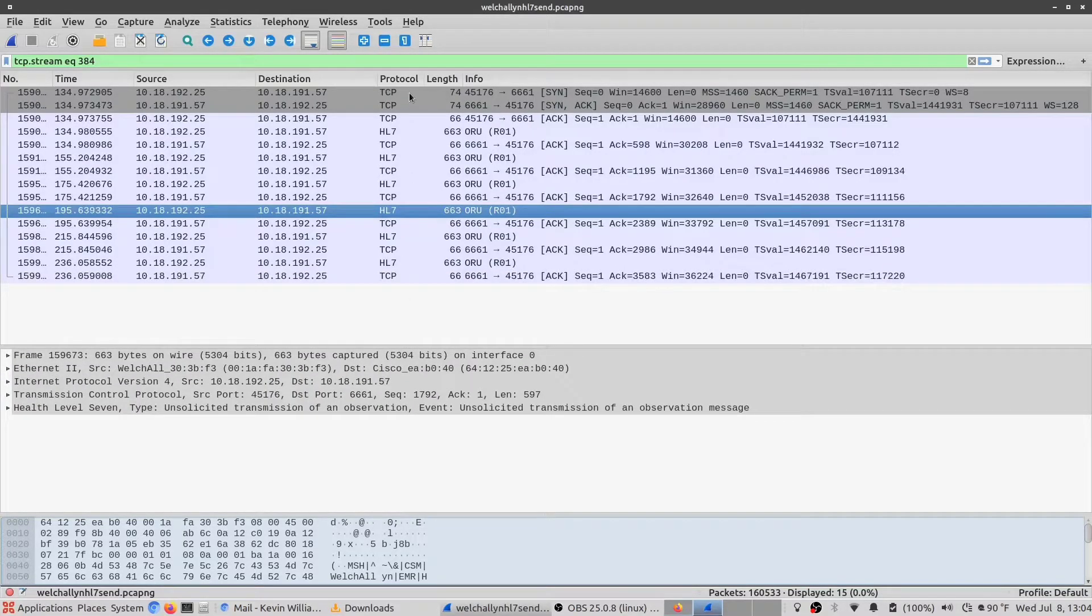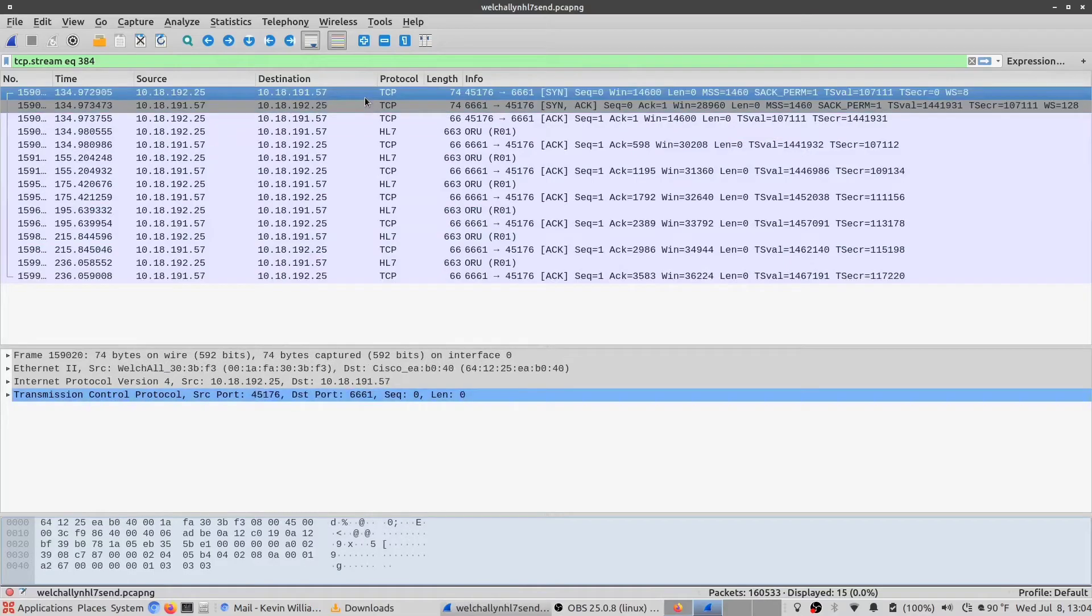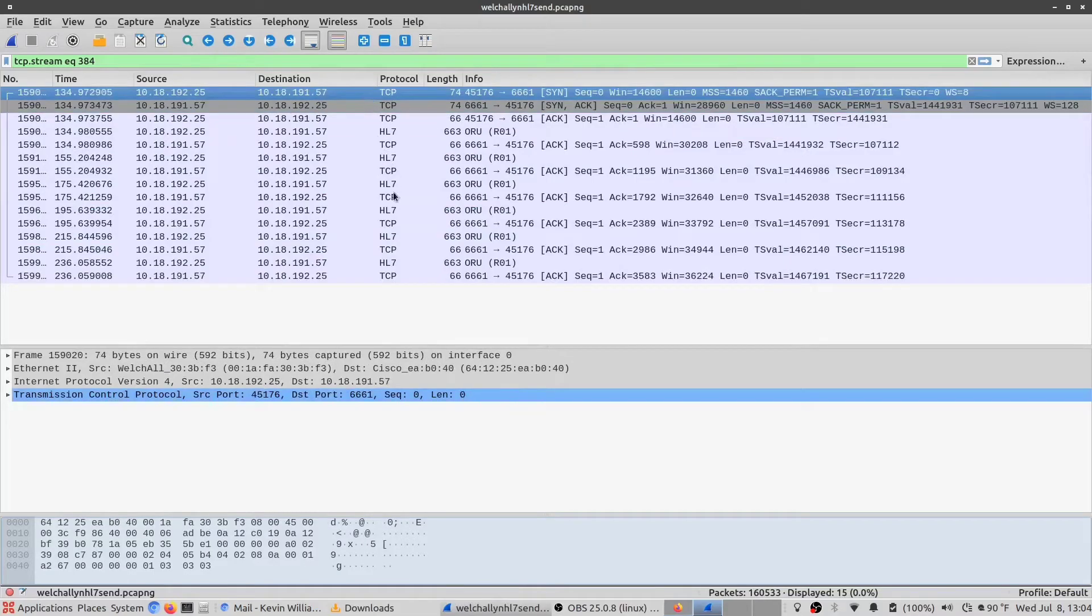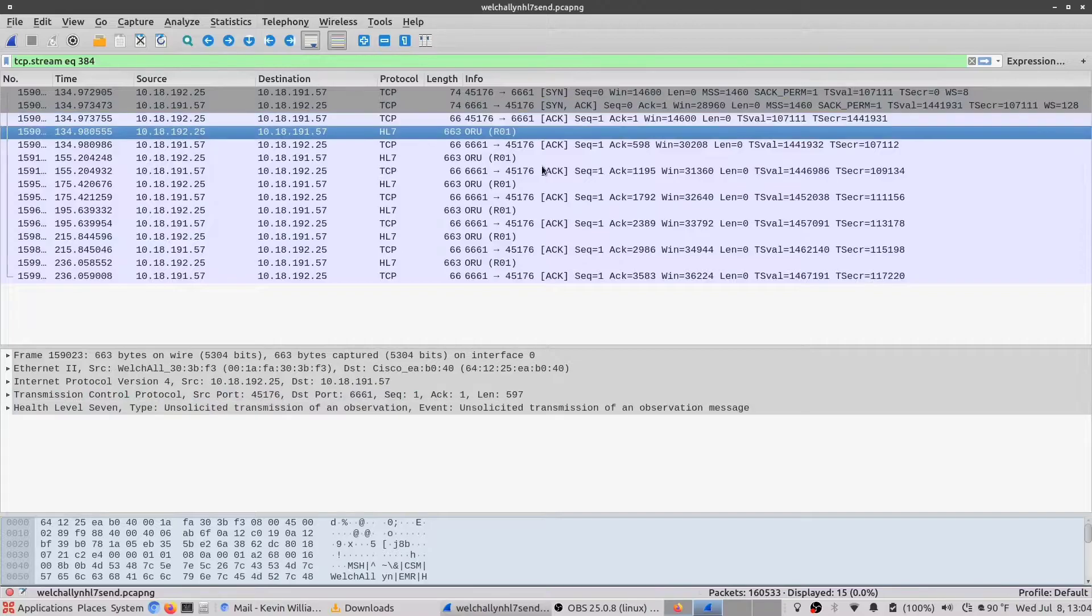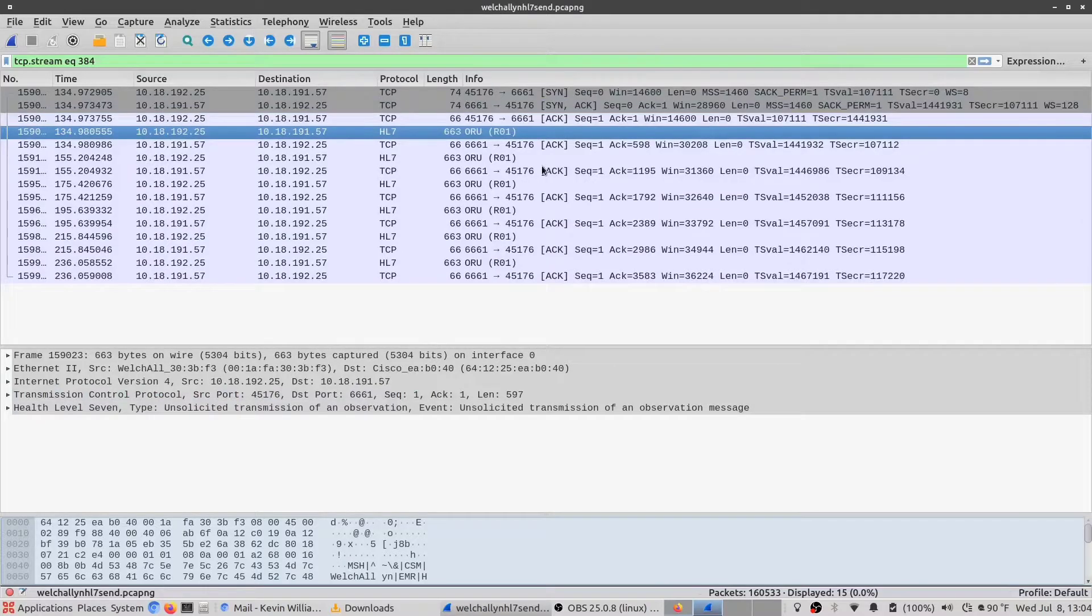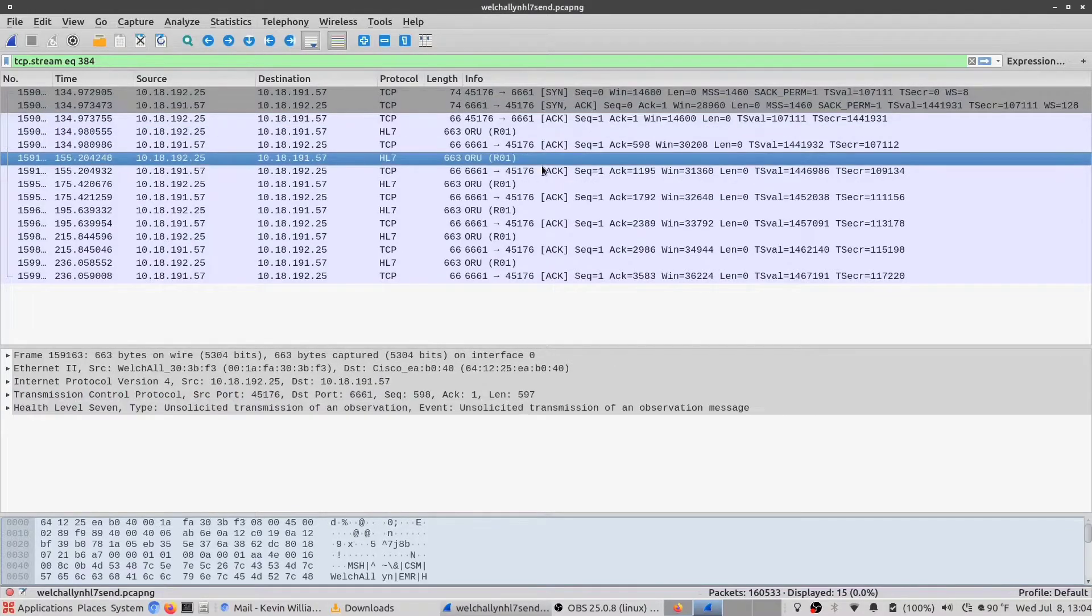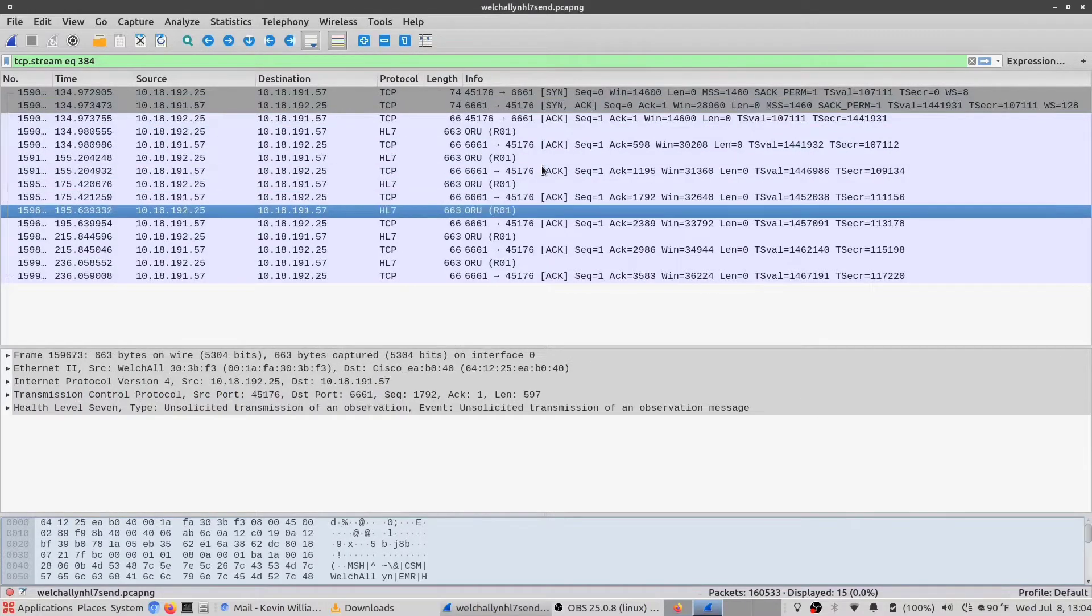So this is the entire conversation taking place between the Welch Allyn and the server, from the TCP handshake all the way down to the final TCP acknowledgement packet.